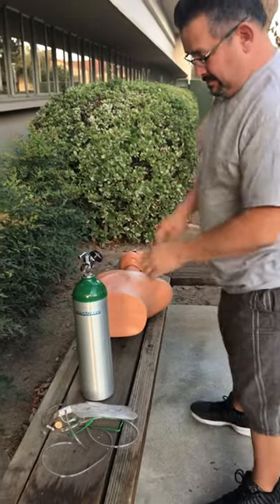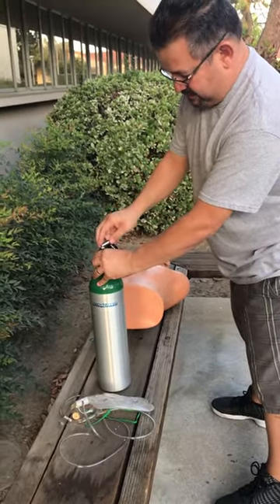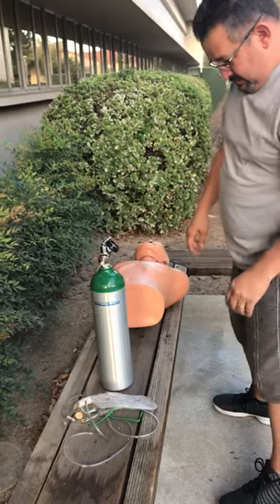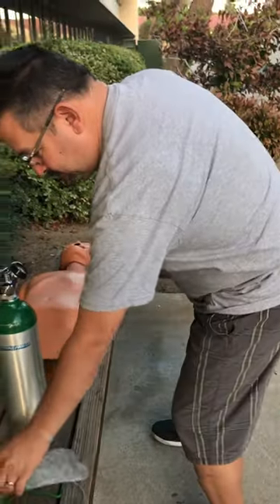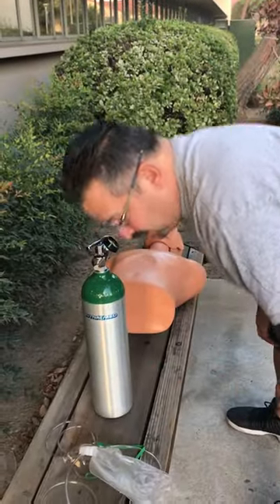Opens the tank valve. Opens the valve. Checks oxygen tank pressure — pressure is checked. Checks for leaks — no leaks.